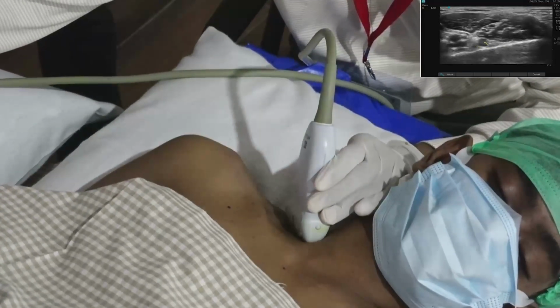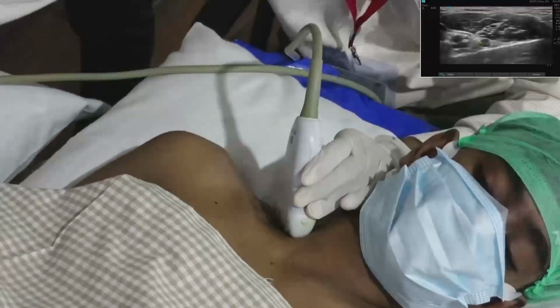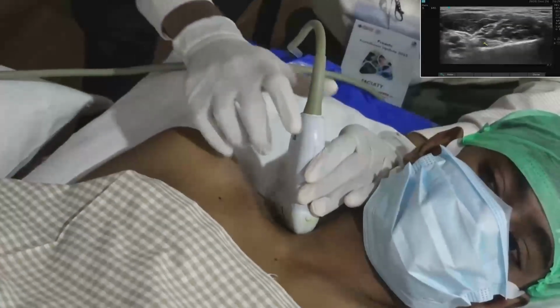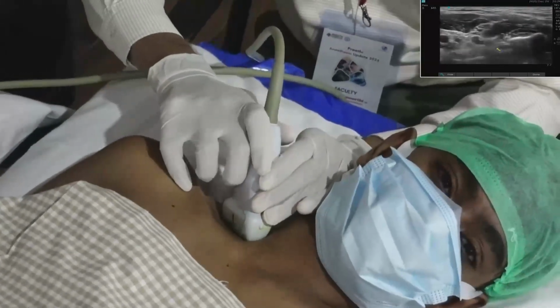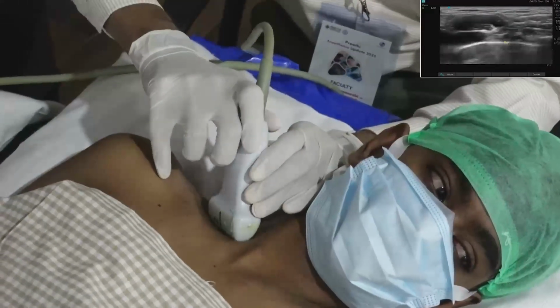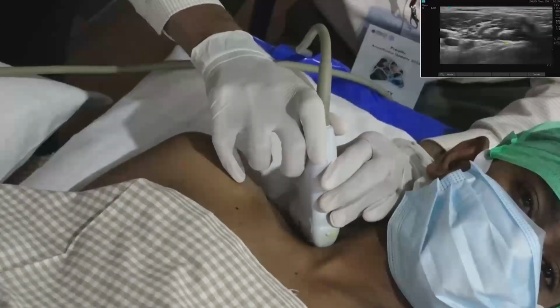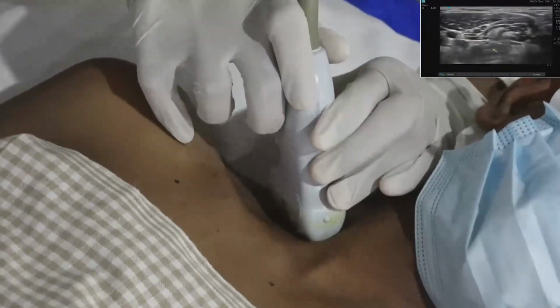Here just above that, if you see one element, that is C8. Whether it is C8 or along with T1, we'll come to know by scanning a little more towards the thorax. If I sweep the probe a little more towards the thorax, probably that element is coming out and going inside.